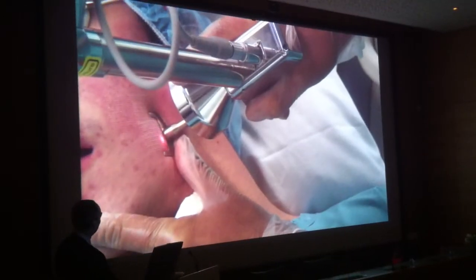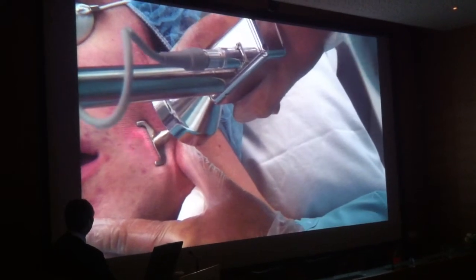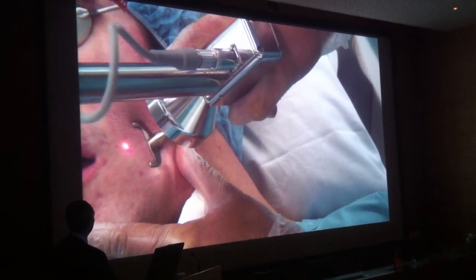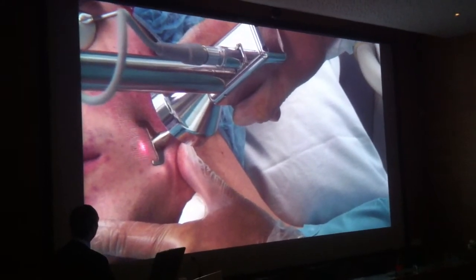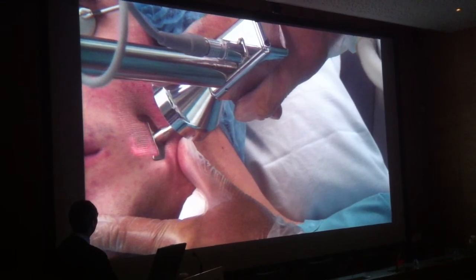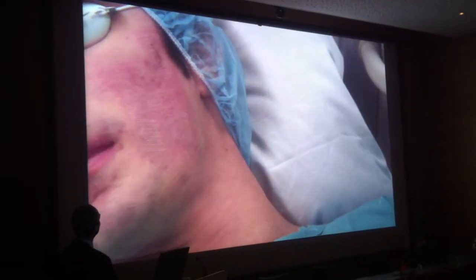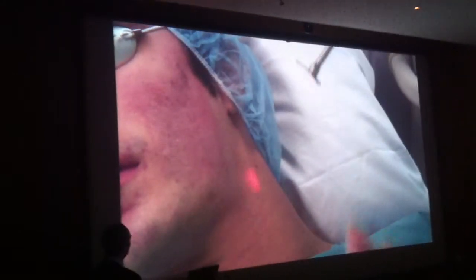One way to promote regeneration is to treat these evolving lesions like evolving scars. Use visible wavelengths, whether yellow or green, or a good pulse like this using a low filter. You can definitely help and improve the condition of that area with biomodulation.